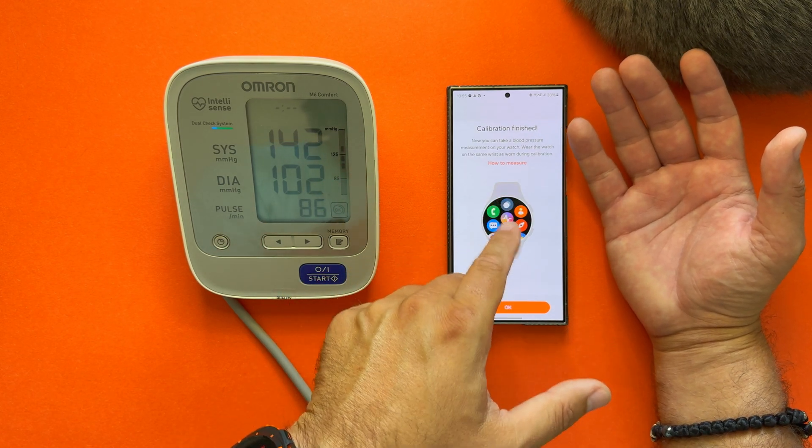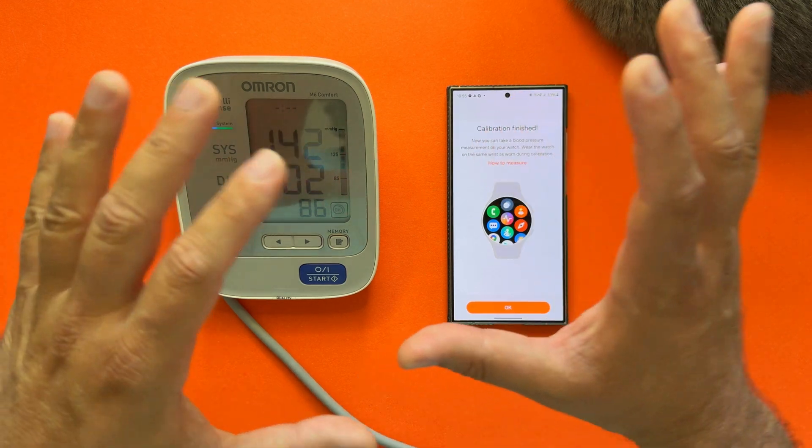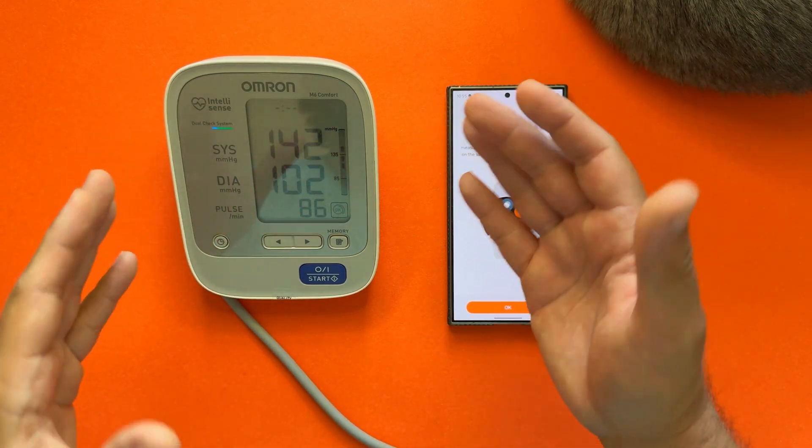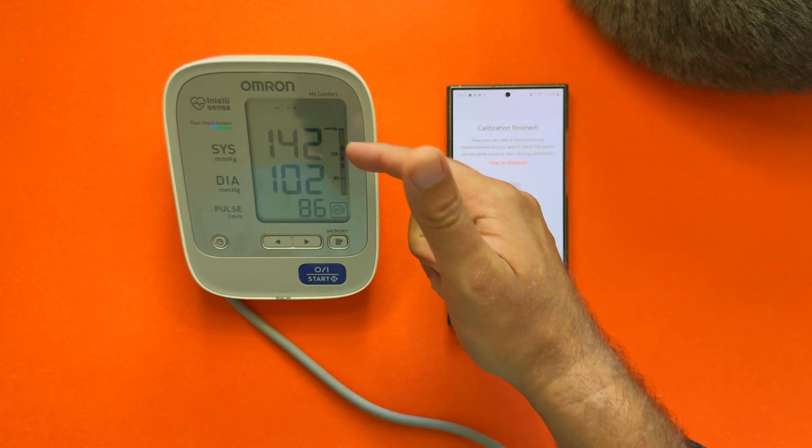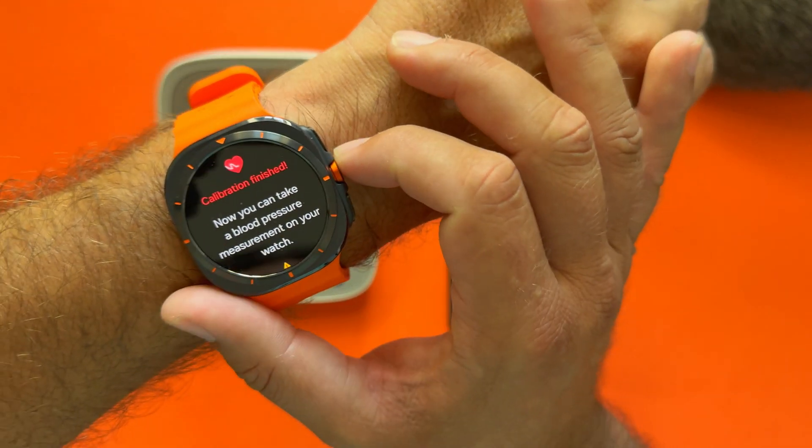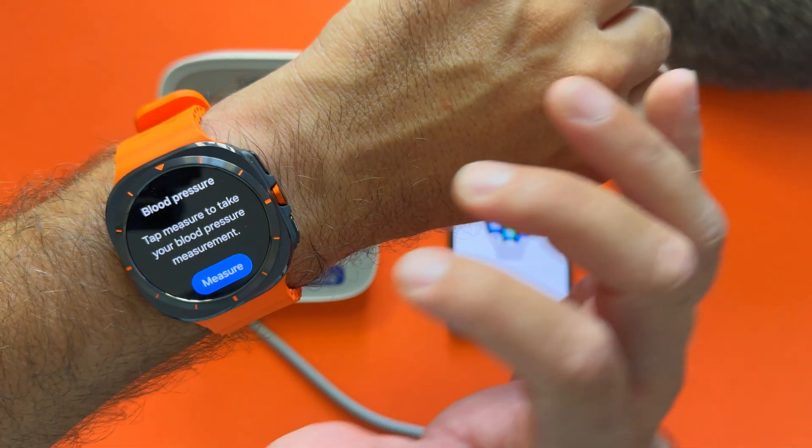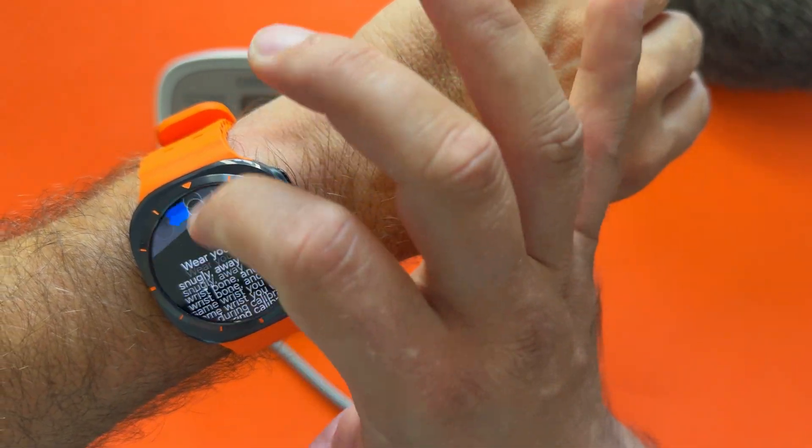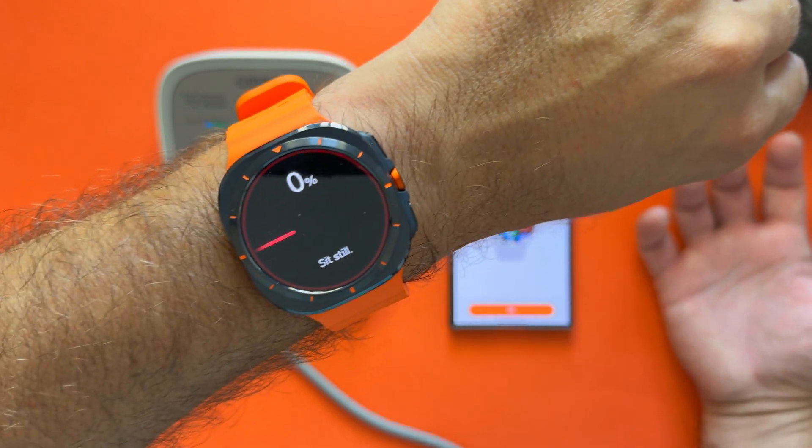Now I can take a blood pressure measurement on the watch. Wear the watch in the same wrist as worn during the calibration. As I have done this, I want to show you right off the bat: I'm going to do a measurement with the watch and then I'm going to do a measurement with the blood pressure monitor, and we're going to confirm if we're going to get the same readings. Let's press OK here. All right, now hit Measure. You're going to get this message after the calibration.